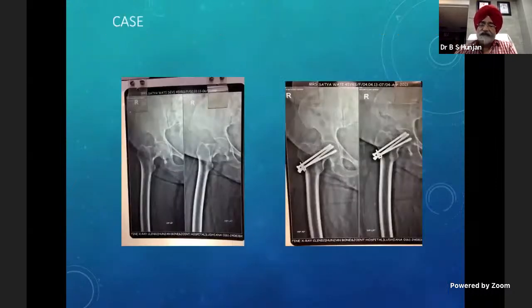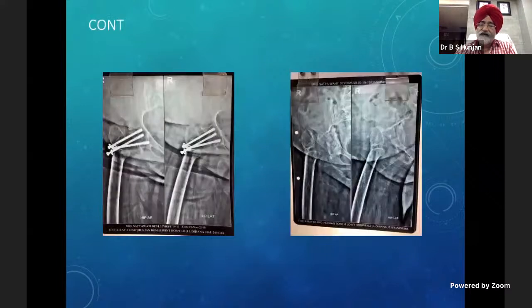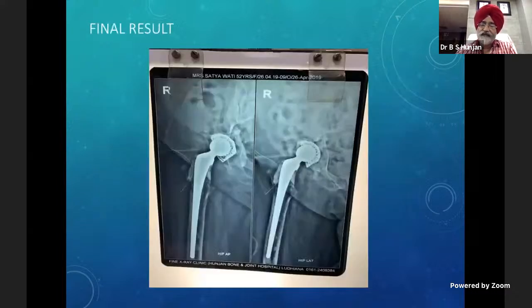Now, this is one case where I'm going to show the acetabular deficiency. This was a case of intracapsular fracture of the neck of femur. It was fixed with 3 screws, and it ultimately went loose and went into non-union. The head was resorbed, and ultimately there is a deficiency of the acetabulum on the medial side. Now, this was ultimately treated with a mesh, and a cemented THR was done with a long stem.